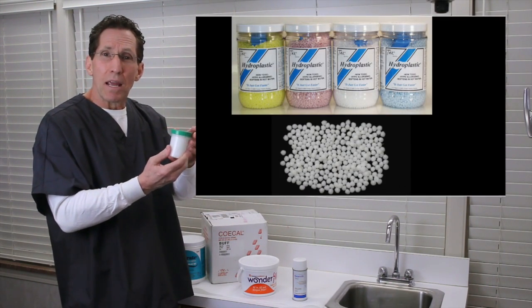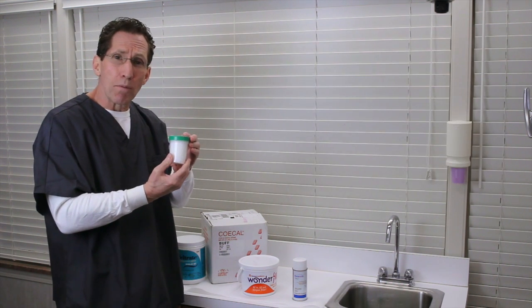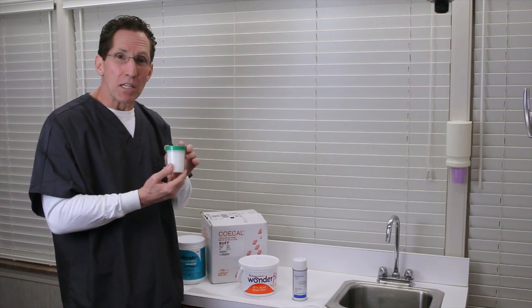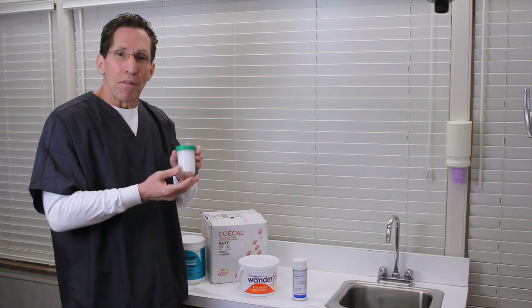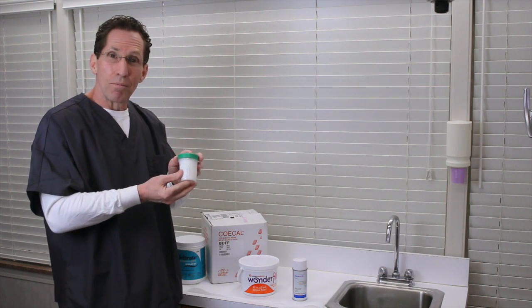And then finally, a material that's not in its original container, but it's a material called tack. This is a thermoplastic that can be heated and molded, and we use it for border molding. Now, with the methods we describe, we don't very oftentimes need to border mold for reasons we'll try to tell you about shortly here. But if we do, this is a very, very nice material for border molding, and we'll demonstrate its use also.